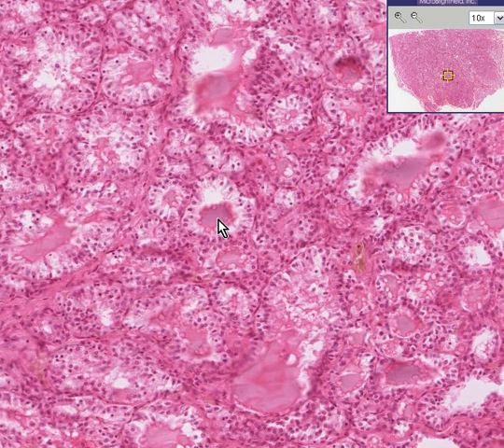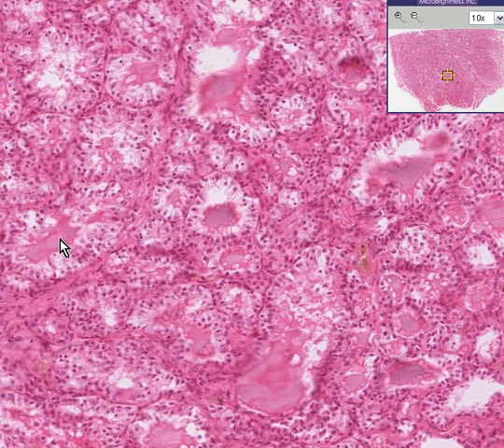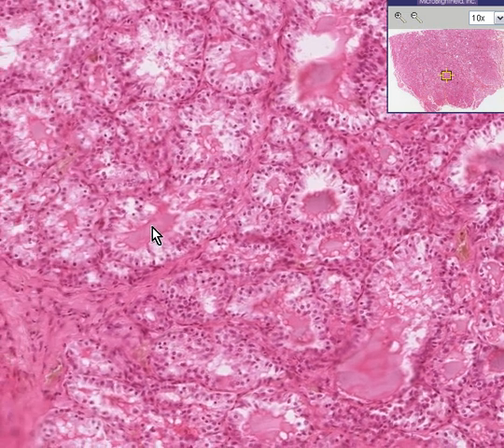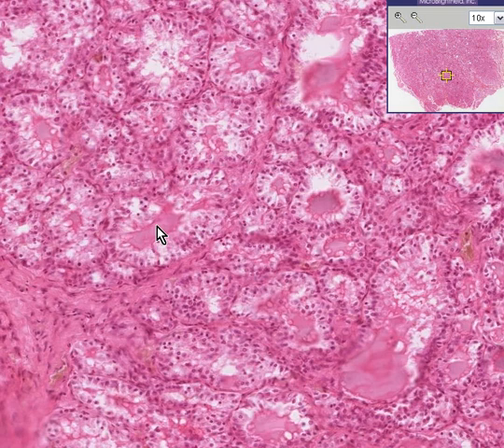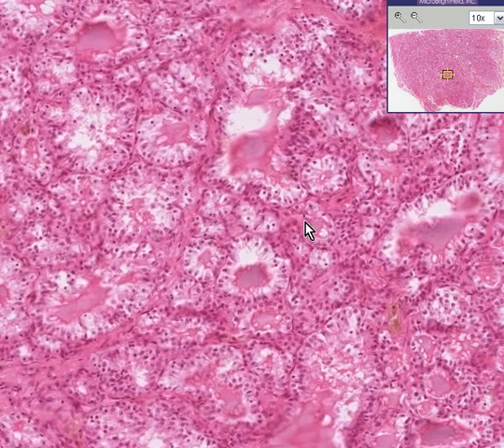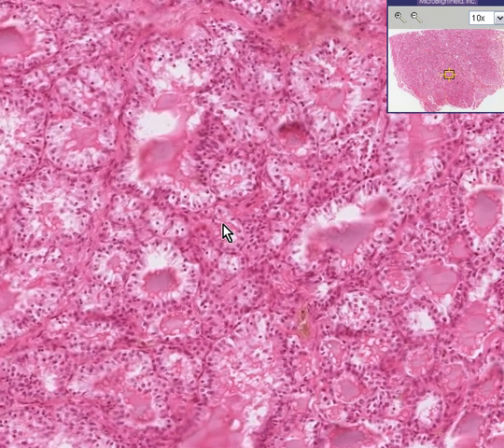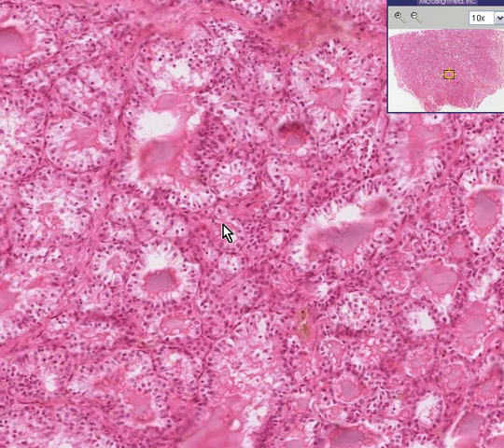There is perhaps a smaller amount of colloid in this thyroid than usual, whereas the colloid goiter in which there was no hyperthyroidism had increased amounts. The reason why this has decreased amounts is because it's being turned over faster. The common denominator of all hyperthyroidism is that the gland pumps out more T3 and T4 hormone.